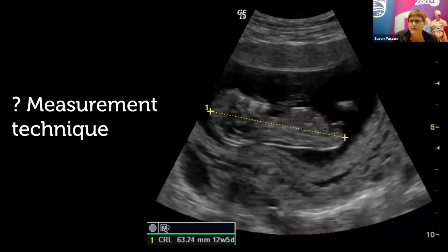So just some very, very simple annotation is going to be able to help you, should you need it down the track. You've been questioned on the results you got or how you integrated those findings into clinical management, and someone wants to challenge you in court. Chances are you're not going to remember that particular patient. And that legal action might come 12 months, 18 months after when you did the scan. So if you can't look at your pictures and have a quick glance at them and easily recognize where the heck you were, then you're in the shtuck.